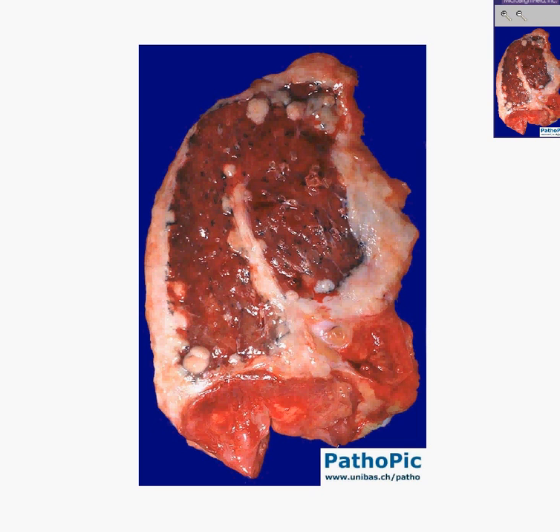They would prefer to call them primary tumors of the epithelium or the mesothelium, which surrounds the lung both viscerally as well as parietally. Here's going to be a section through this little pleural area now, which is extremely thick because it's tumorous.